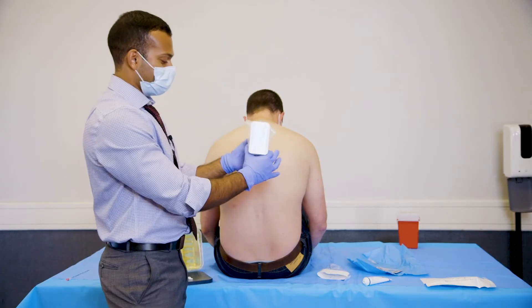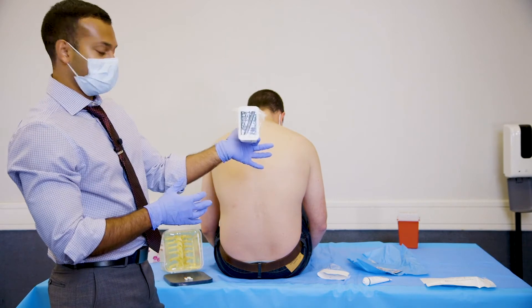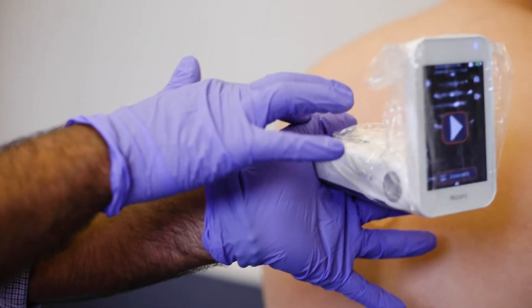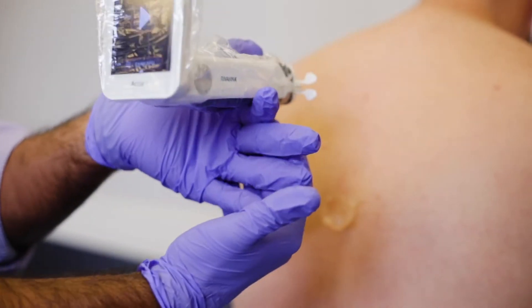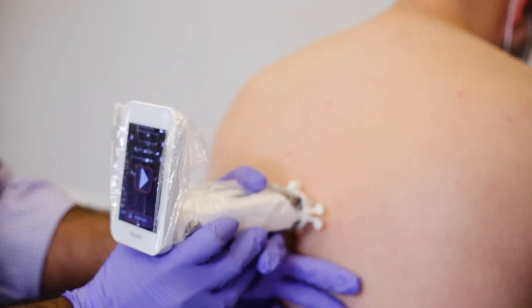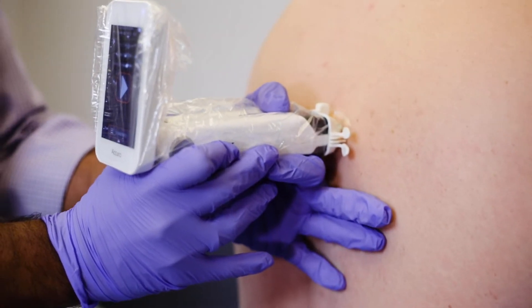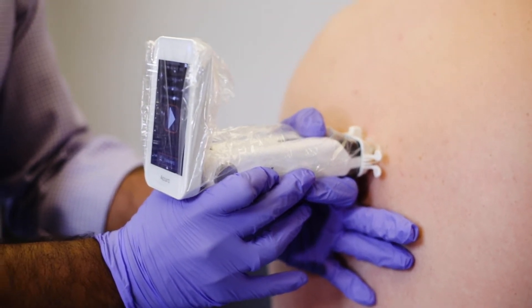Now the most important thing is how you hold this. You want to make sure you're stabilizing it so it doesn't move. An easy way to do this is have your thumb facing up and your fingers facing down. This way it's going to be balanced on the back of the spine so you can easily move it up and down with slow and controlled micro movements.